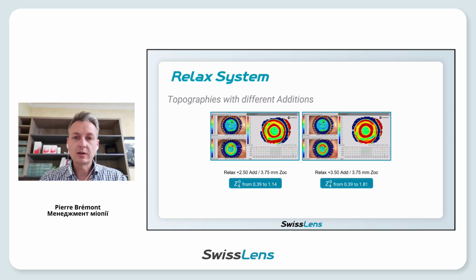With 3.5, we are up to 1.81 in spherical aberration, and the patient didn't like this lens. It lowered the visual acuity too much. We changed to 2.5, and then the subjective comfort was much better, and the spherical aberration result is perfectly achieved, 1.14, which is enough.